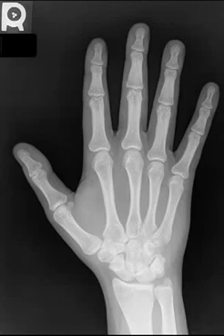Welcome back. This is Dr. Jamie Motley, and I will be covering a standard radiographic examination of the hand. Standard projections of the hand include PA hand, medial oblique hand, and lateral hand.